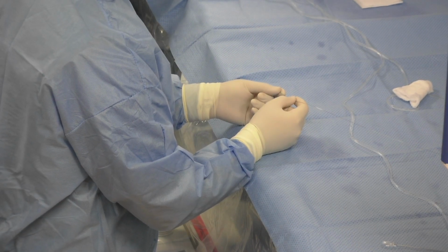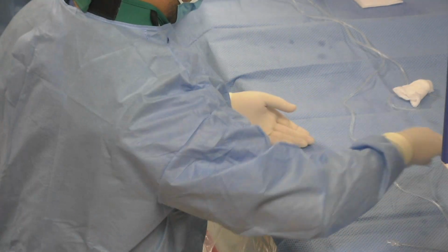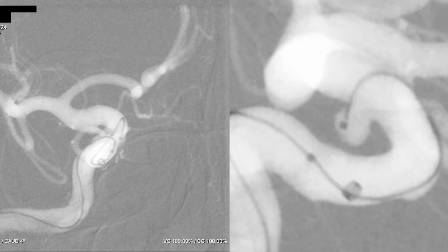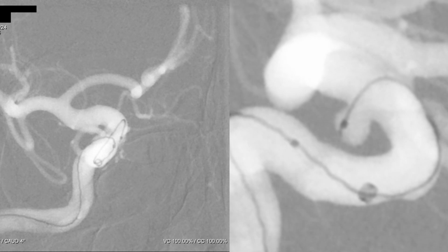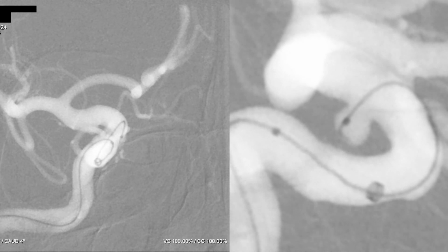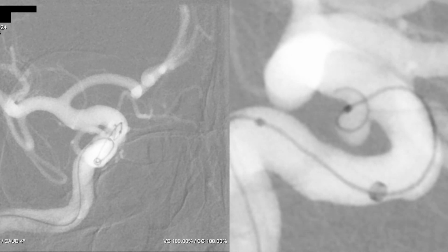And this is the first coil. It's the big one that we've discarded. As you can see, there is a little bit of tension on the coil. That's why we try to pull the microcatheter and push the coil a little bit.